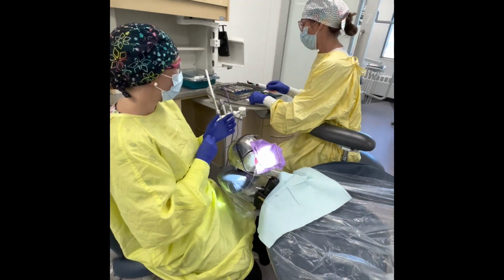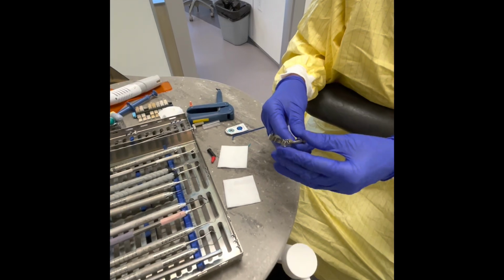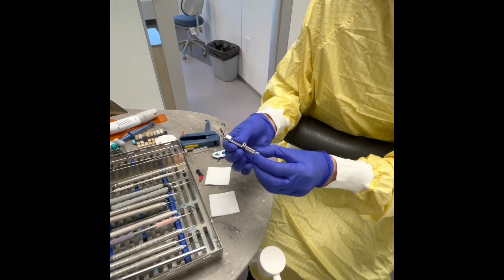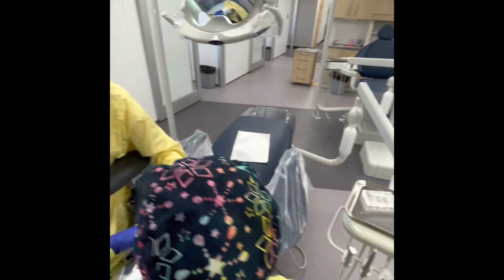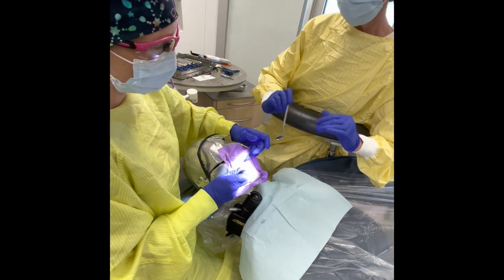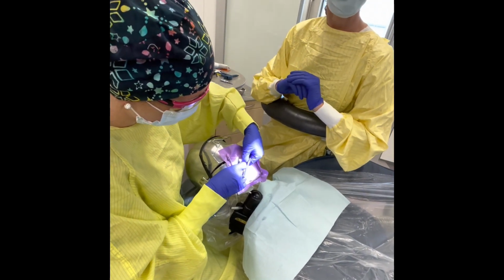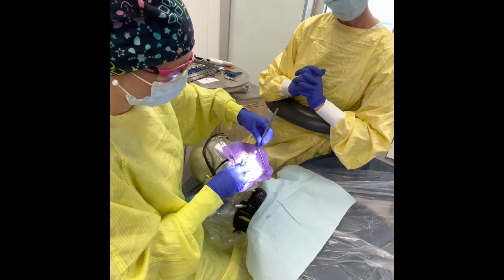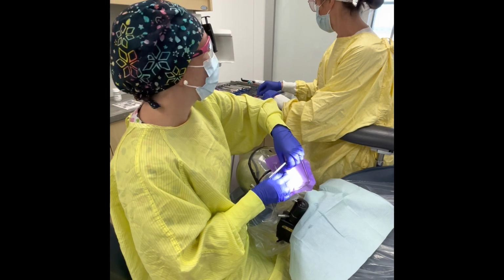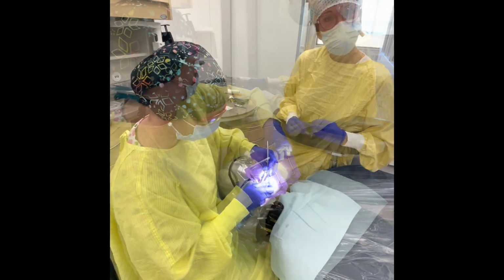All right, so I have my Tofflemire already set up. I set it up at the beginning when I knew that we were doing a 1/6. So I have it set up to the upper right, and I'm going to pass that to Amanda right away. Perfect. And I will take my mirror as well, please, Stacy, so I can see. Your operator might put his or her mirror down on the tray or behind them. Don't worry about that. If they have to ask for it, it's not a big deal. Not at all. I have a tendency of putting it anywhere, and any operator you ever work with, it goes wherever they choose. Amanda has put on her band.